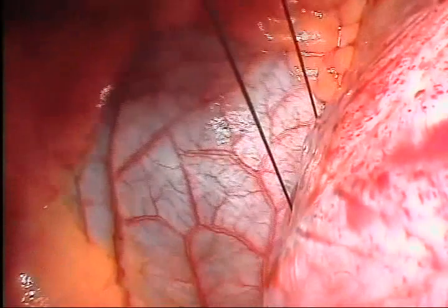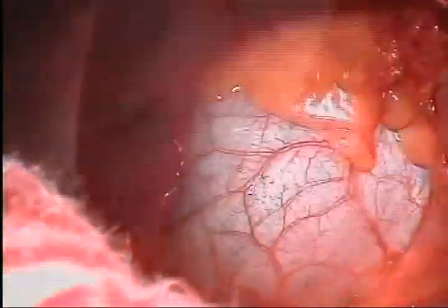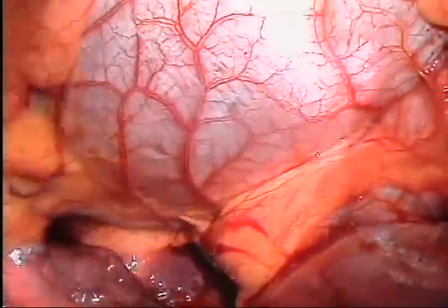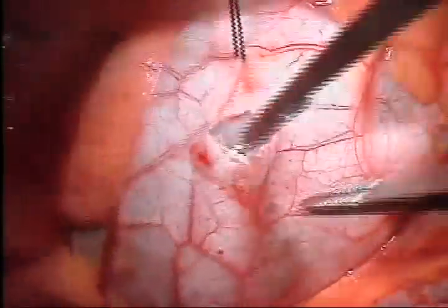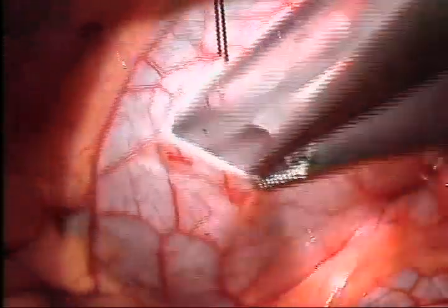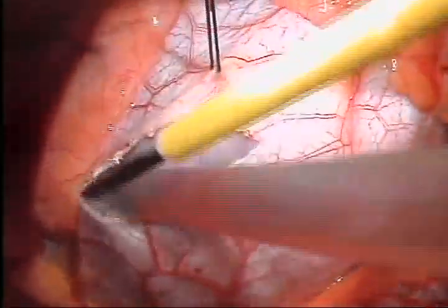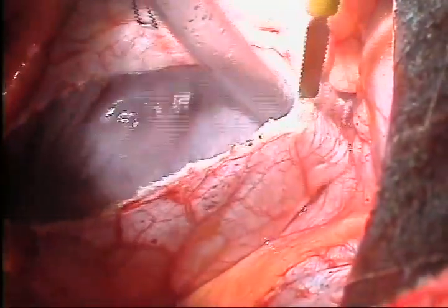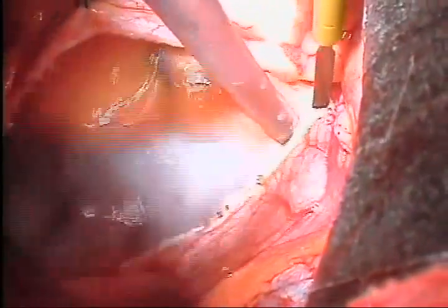The first step in cardiac exposure is retraction of the diaphragm with a 2-0 suture. This is pulled caudally, exposing the pericardium. The phrenic nerve is identified in order to ensure that the pericardium is opened well anterior. The pericardial incision is made approximately 3 cm anterior to the phrenic nerve and extended up toward the aorta and then down to the inferior vena cava, with suction protecting the heart. The right atrium is immediately visible.